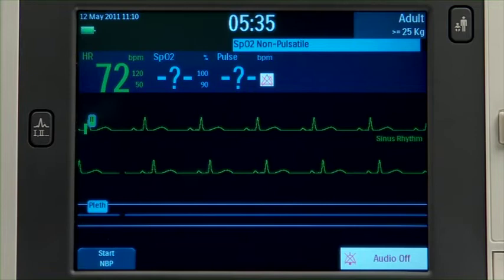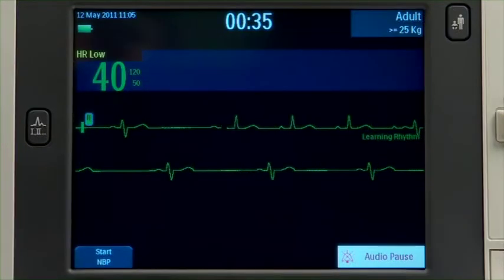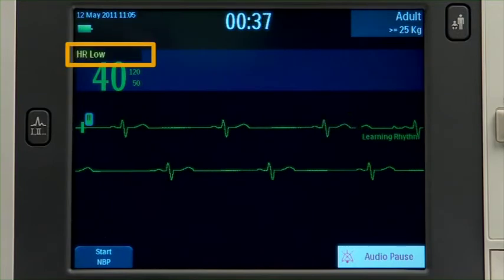Technical alarms indicating an equipment problem appear here. Physiological alarm messages appear next to the parameter they are associated with.